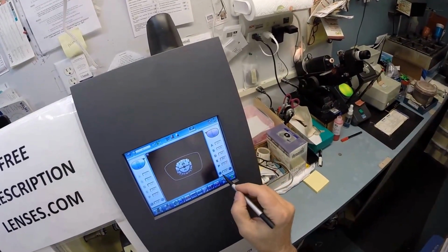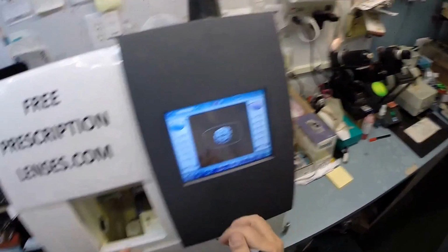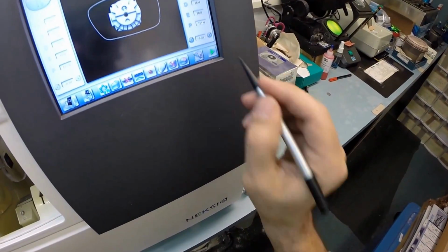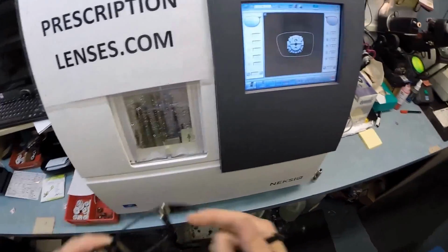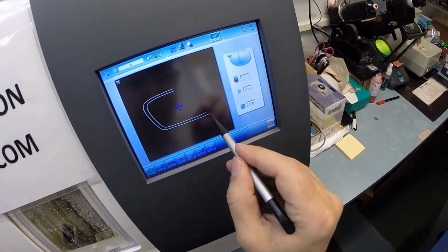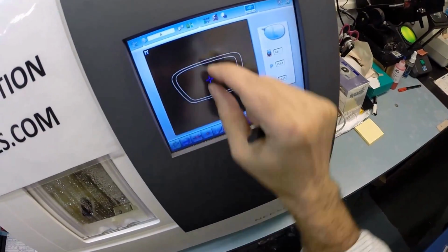We're gonna flip that over to L, and actually we're gonna polish that and put the lens into the chuck. Thank you, Chuck. And hit start. Now this time it's going to come and trace the shape of the left side of the frame. As those two styluses go around, it is tracing the shape. Of course the outer edge is a little bit thicker, that distance there, than it is here, and of course it's very thin at the top.